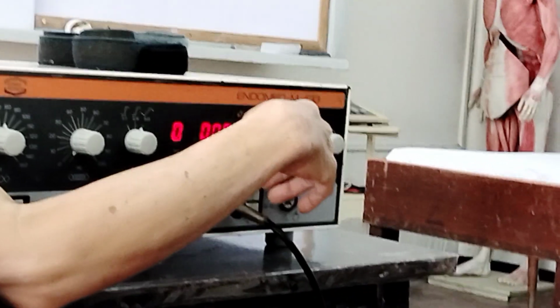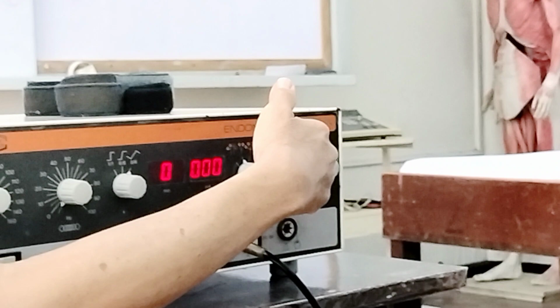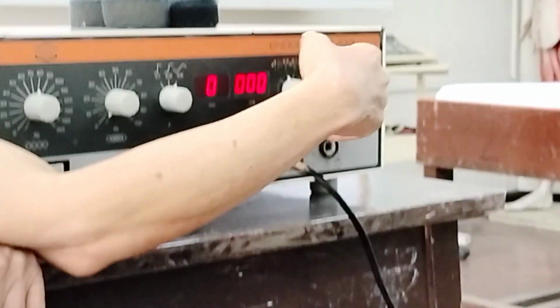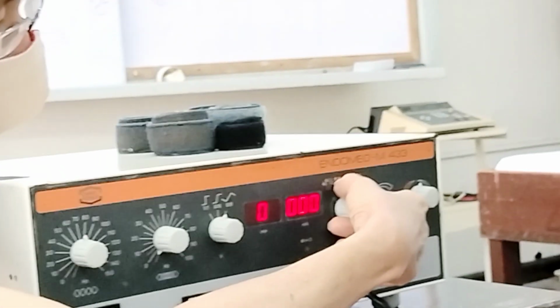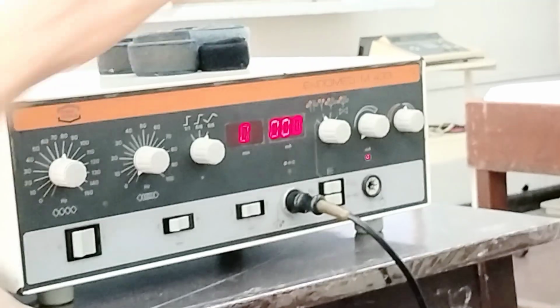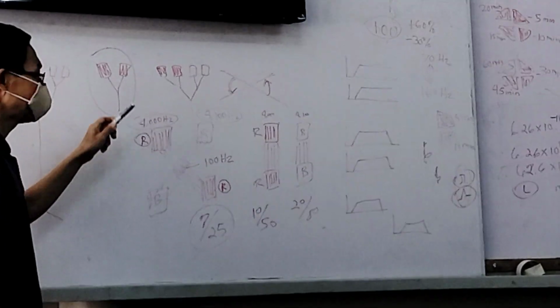Ayan sa muscle stimulation. So the other 3 there, going towards the right, the second, third, and fourth, is for pain relief. Okay, so here, on the second portion, kanina, you can see there that there are colored orange or red. So you have this symbol na kanina, you can see this one, diba? Like orange or red.